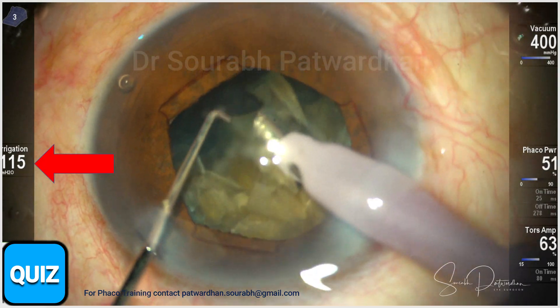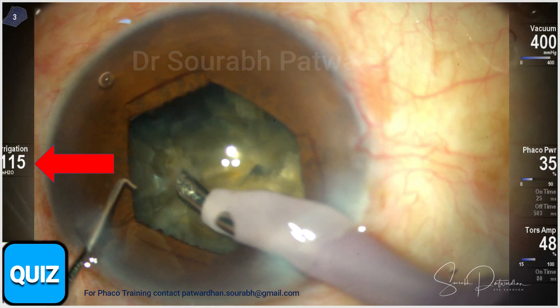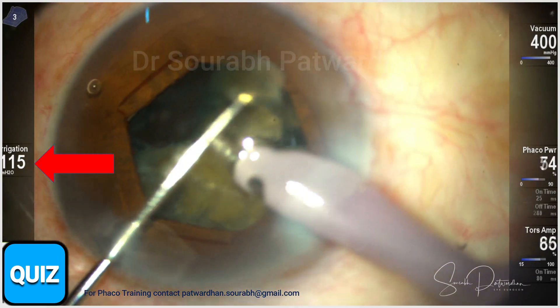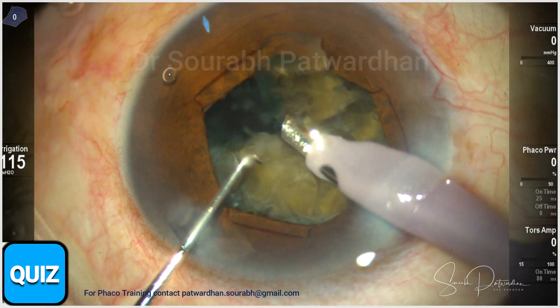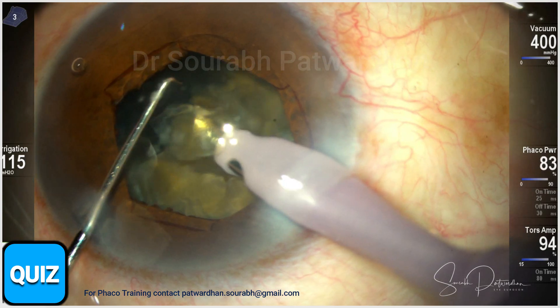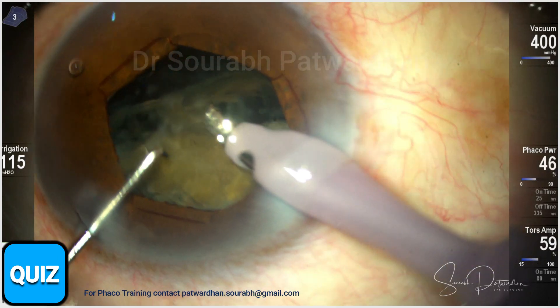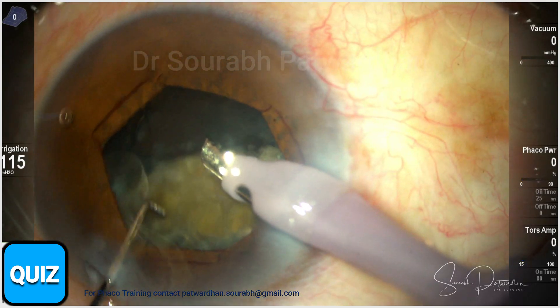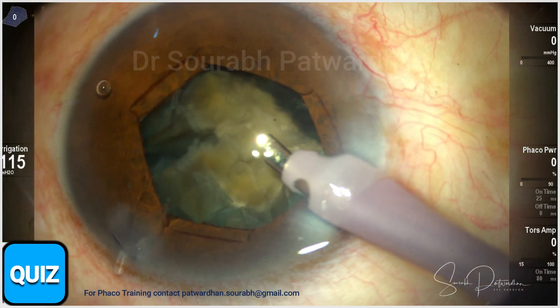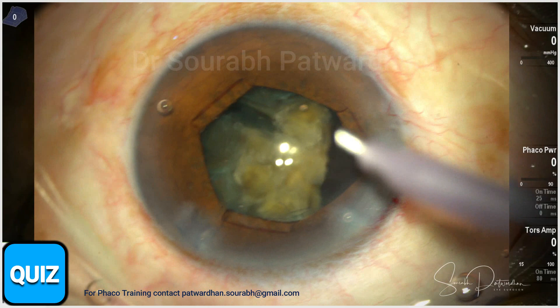Watch the parameters I'm using here. I'm using 400 vacuum and 115 centimeters IOP equivalent — 115 centimeters of water height — taking out the pieces one by one. Very good followability. The entire chamber is rock steady with no fluctuations at all. I keep my phaco tip right at the center of the chamber, which is the deepest part. Once the first half nucleus is over, I take a break to replenish the dispersive OVD.